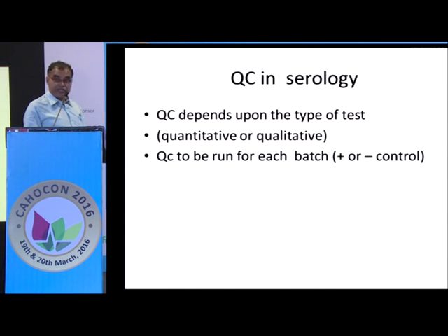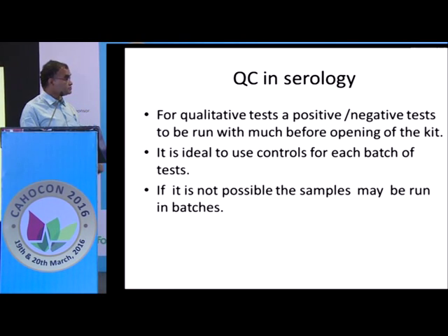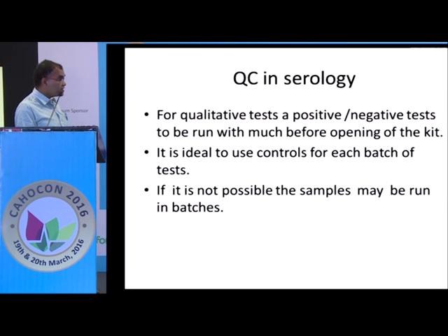This is what I was trying to tell you. QC in serology will depend on the type of the test, and you are supposed to run a positive and negative control for each batch. And for qualitative tests, you need to run the test even before you open the kit.